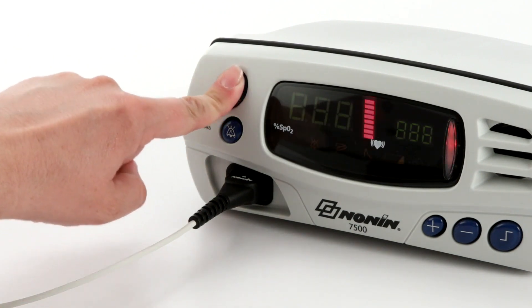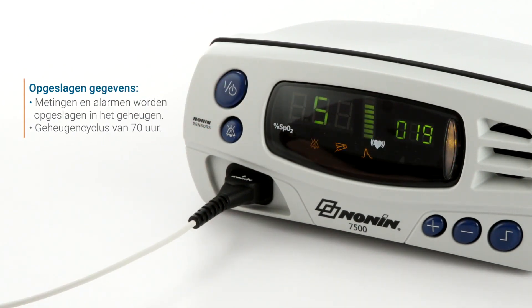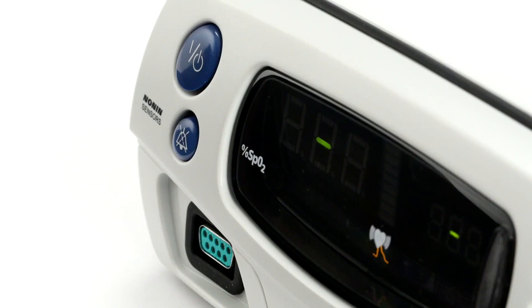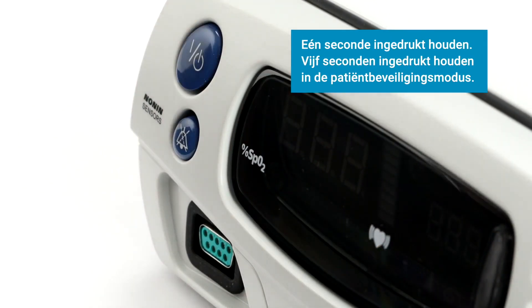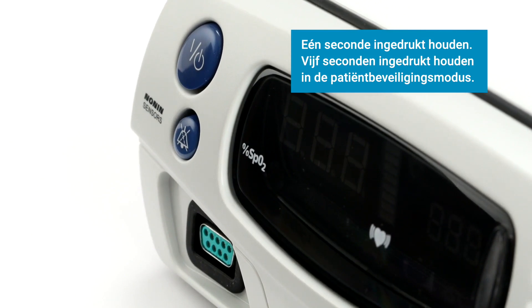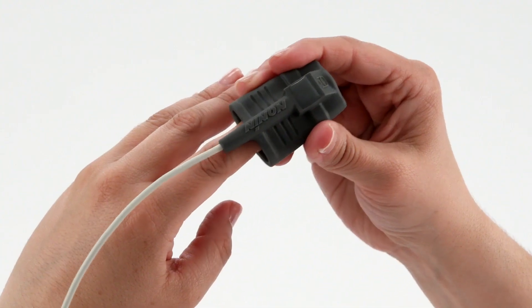Stored data is retained for the last 70 hours of use and then records over the oldest data in four-minute segments. Data can be downloaded and analyzed on Nonin's Envision software. When you're ready to stop using the oximeter, simply press and hold the on-off button until the oximeter turns off — hold for one second in normal function and five seconds if the oximeter is in patient security mode. Then you can unplug and remove the sensor.